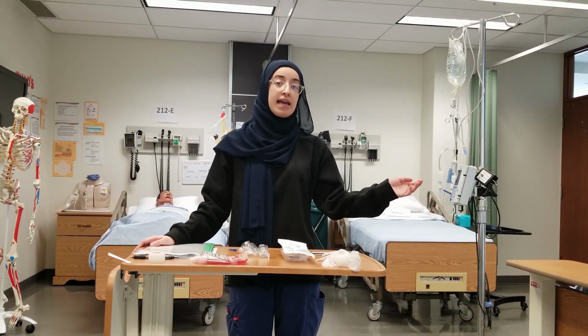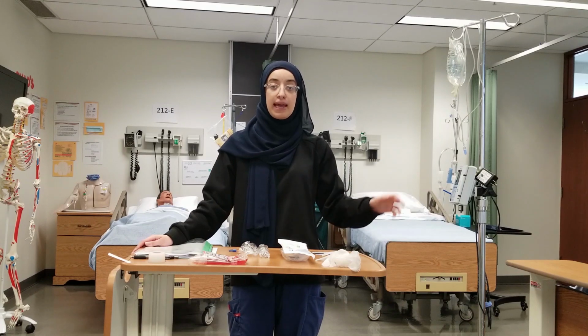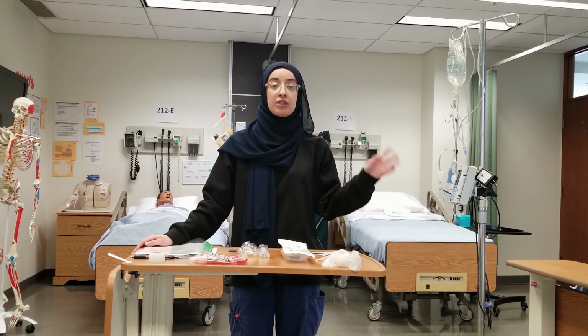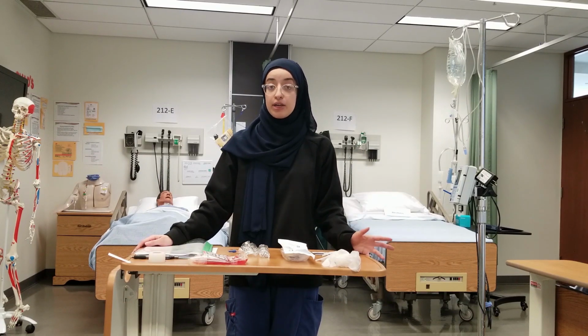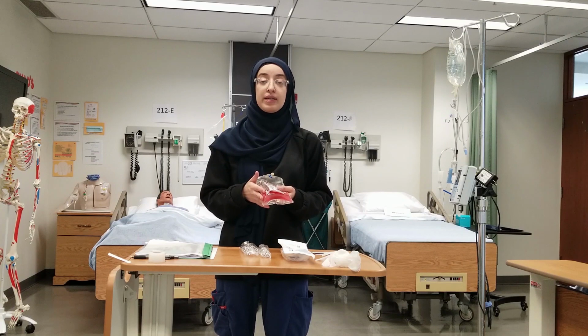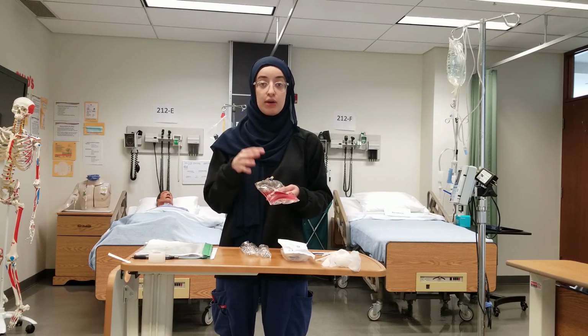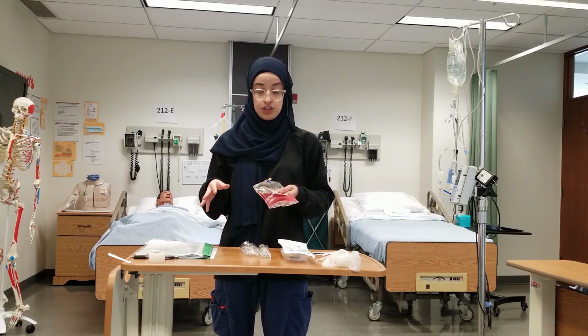So I've gone ahead and primed my tubing, so it's all set to go. This would be in the patient's room just to make it easier once I get back to start the infusion right away. Next, I'm going to go to the blood bank with my blood bank voucher and I'm going to get my blood products. We want to make sure that the blood work has been done ahead of time to determine the patient's blood type, to make sure that we're not giving something that is contraindicated.